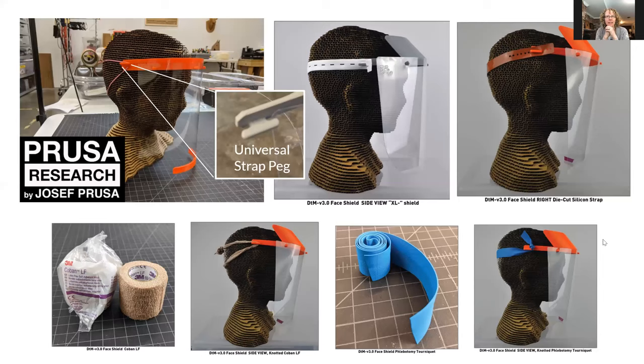Well, the amazing maker community worldwide had already started on this, and we believe face shields could be one way to help because there's a big potential for them to be easily reusable and cleanable and quite safe. So we actually started with this design from Prusa, which has made it around the world, and really impressive work that they did to get this out there very quickly. And I think many, many thousands of these have been printed around the world. So starting with a design that already exists and has already had some clinical vetting is one of the great benefits of open source design.